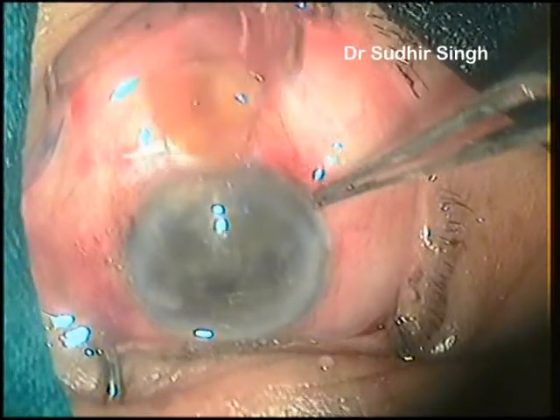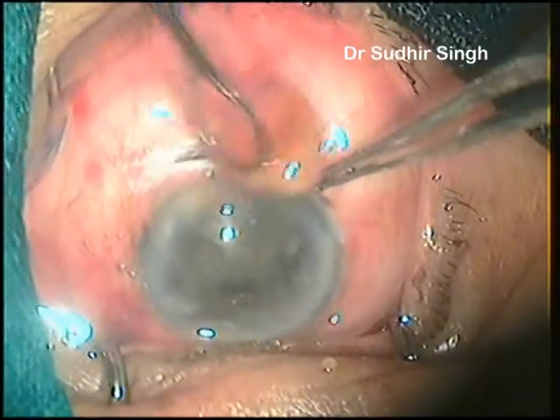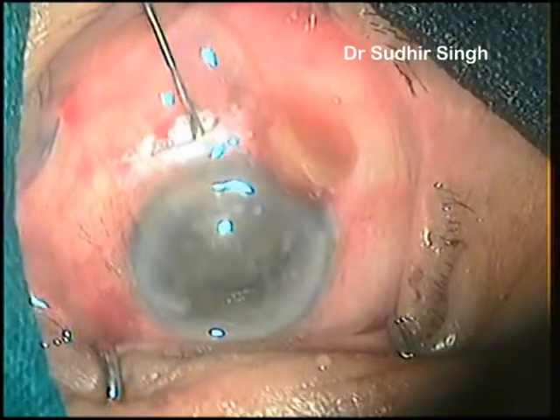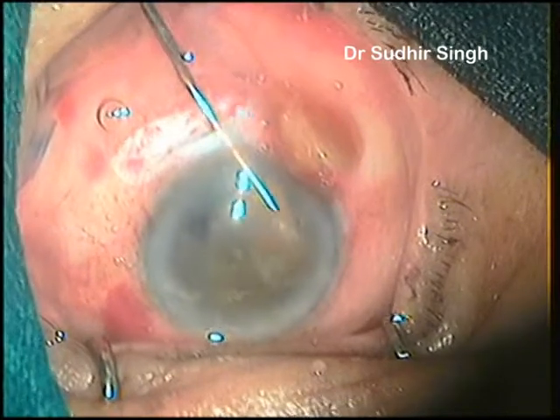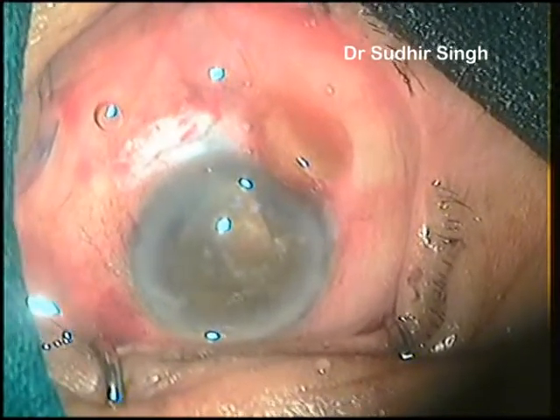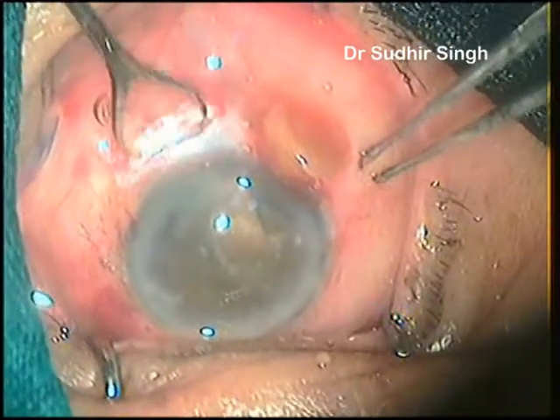The broken posterior part of the nucleus is taken out and the remaining anterior part is pushed back into the anterior chamber. The longitudinal axis of the remaining nucleus is made parallel to the tunnel and taken out by the vectis.